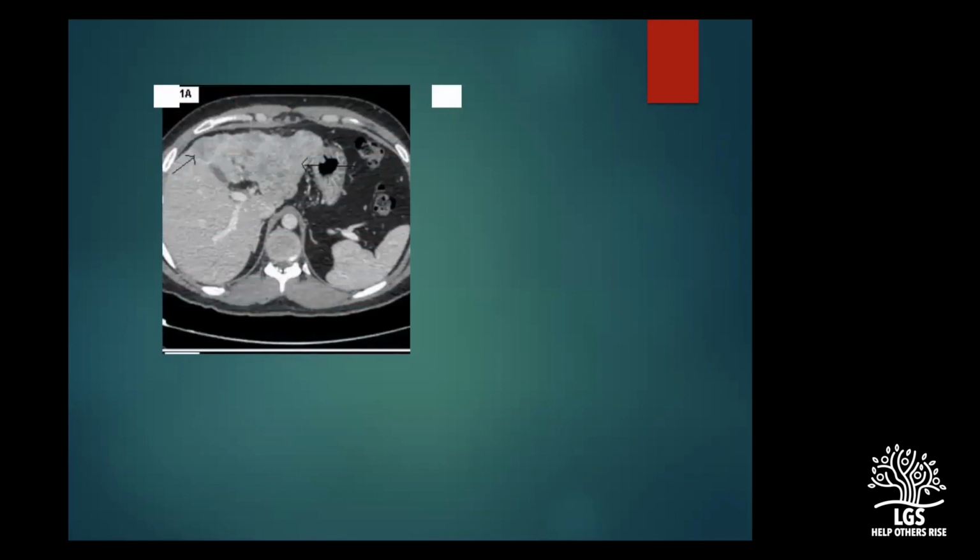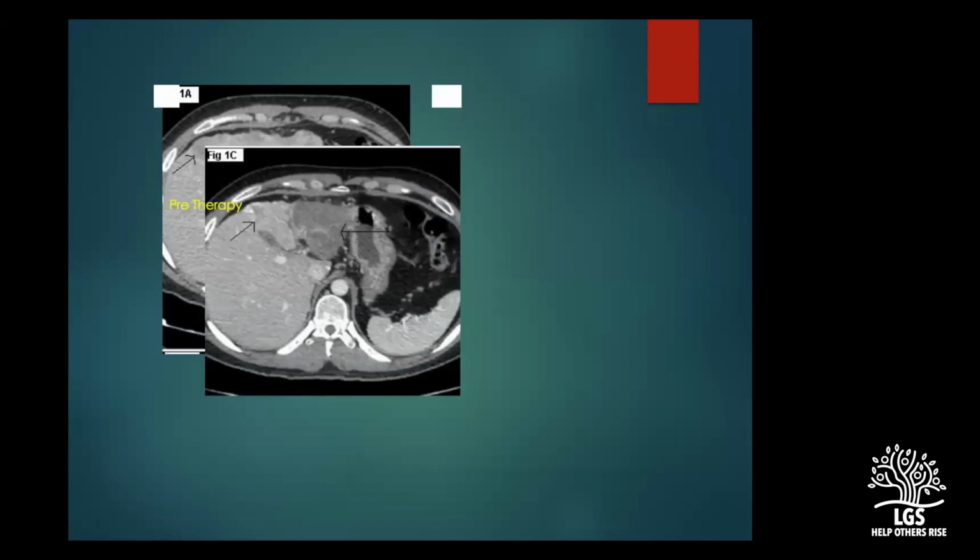And this is one of the patients for whom we offered a TARE, wherein you can see that this was a 28-year-old patient, if I remember correctly. And what you can see is the entire left lobe has got diffuse HCC. His AFP was sky high, actually, and it's quite diffuse HCC. His portal vein was patent, and this was pre-therapy. So we offered TARE, and what you can see is that the entire left lobe is completely shrunken.